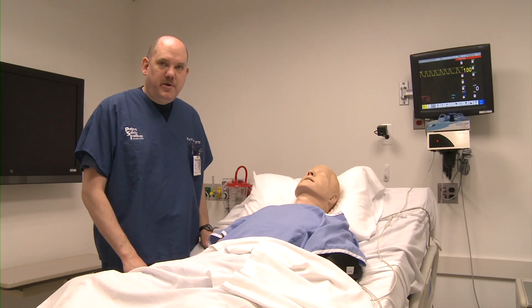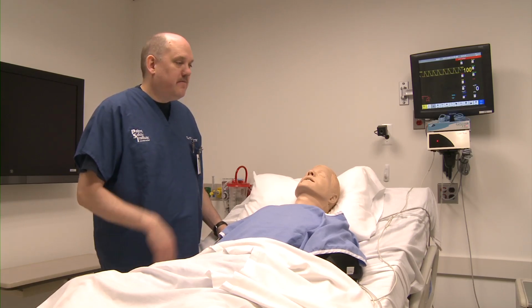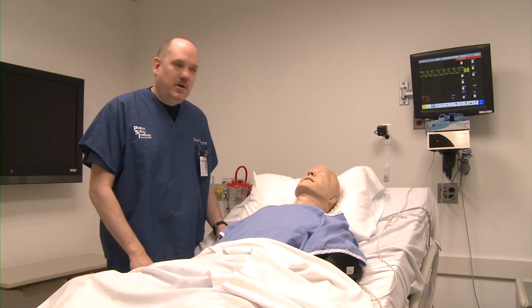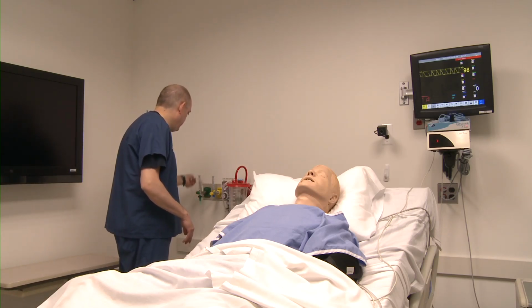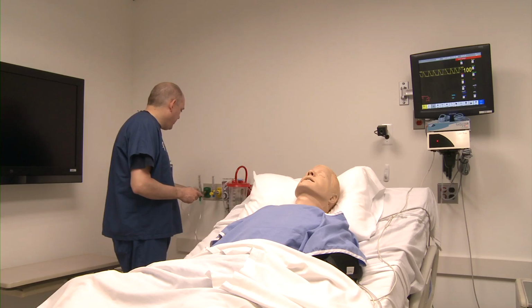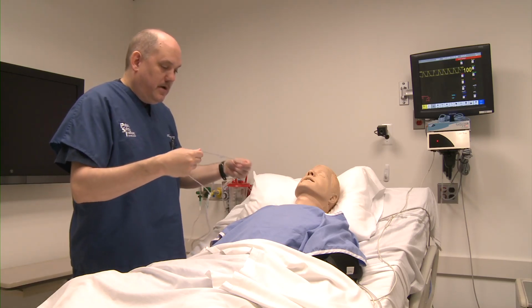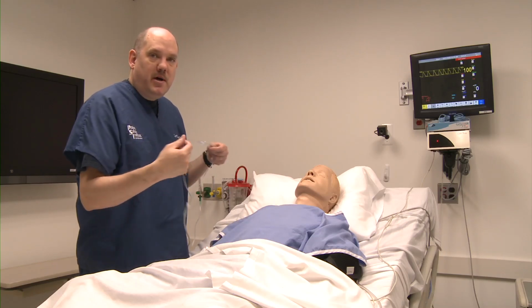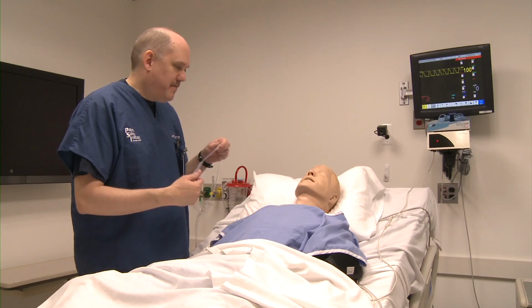If your patient's condition warrants the administration of oxygen, you may select an appropriate oxygen administration device from one of our bedside tables, hook it up to the oxygen regulator hanging on the wall here, turn on the oxygen, and apply it to the patient. Oxygen masks can be applied to SimMan without any difficulty whatsoever. You'd apply them in the normal fashion.